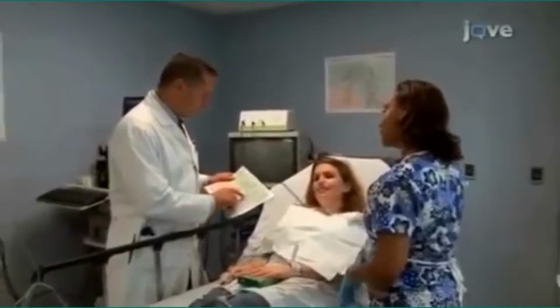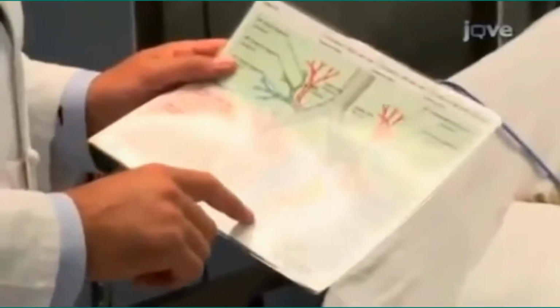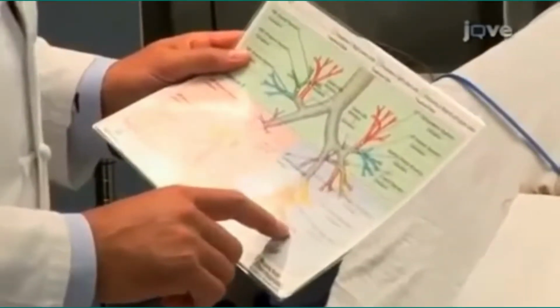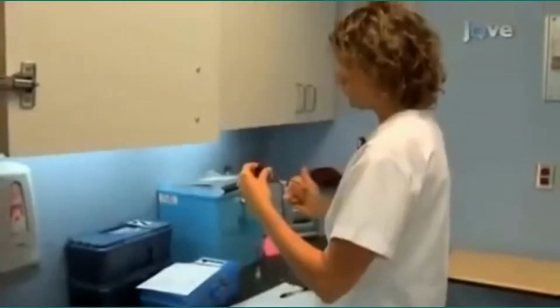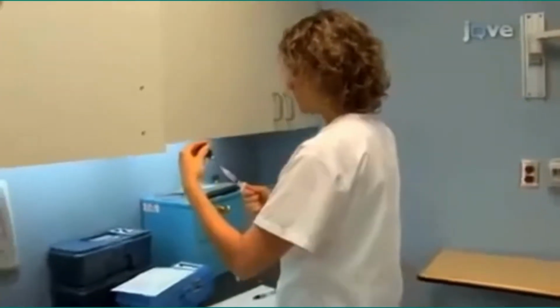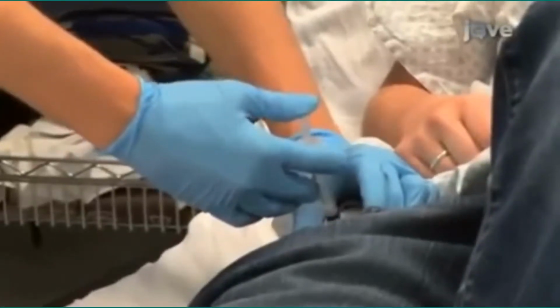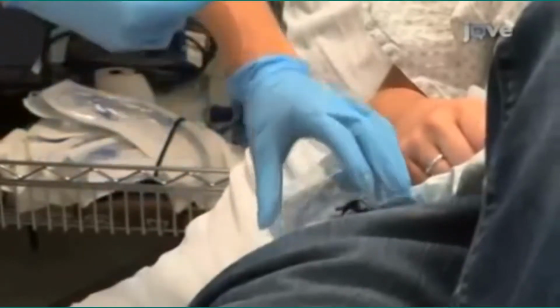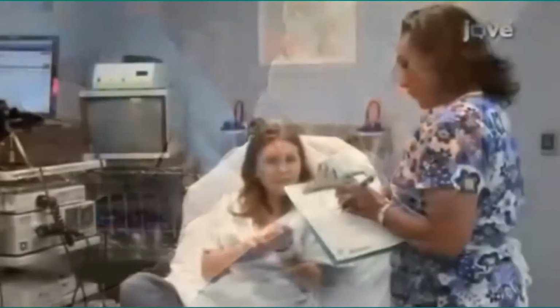Segments are to be assessed and treated. Treatment planning is crucial to the thoroughness and ultimately to the success of bronchial thermoplasty, helping to avoid under or over treatment of the airways. To help suppress airway secretions, an anticholinergic such as glycopyrrolate is administered at least 30 minutes prior to initiation of the procedure. Properly treating the patient with an effective drying agent such as glycopyrrolate is important in bronchial thermoplasty, as it reduces the amount of airway secretions and may improve visibility through the bronchoscope.